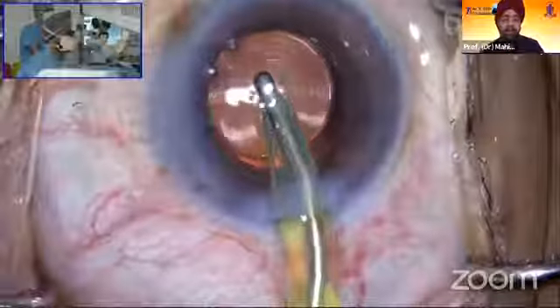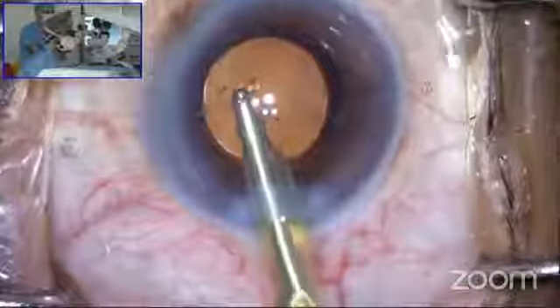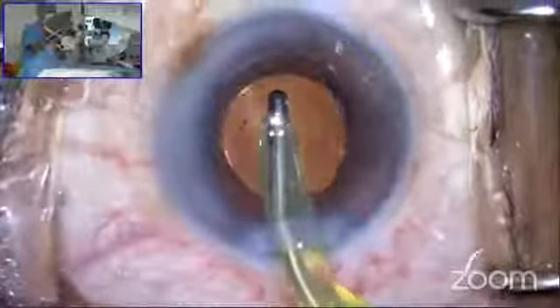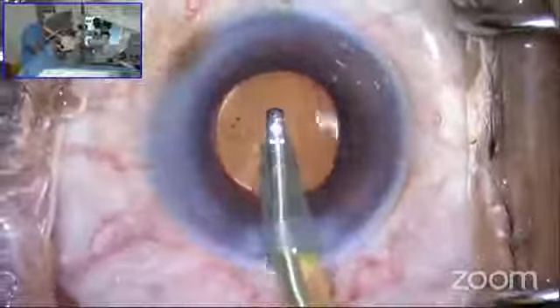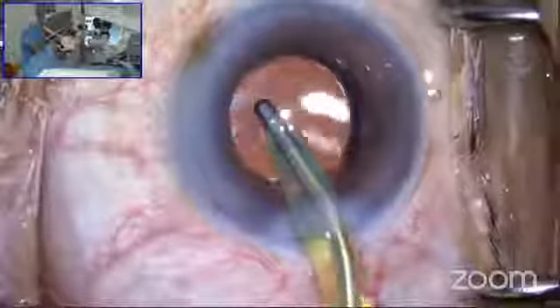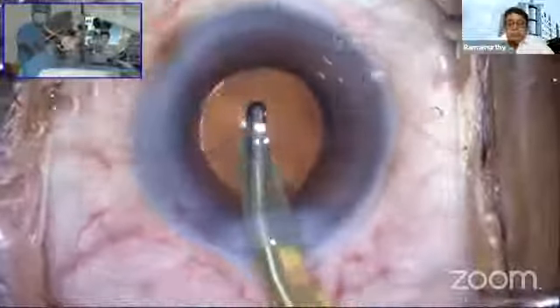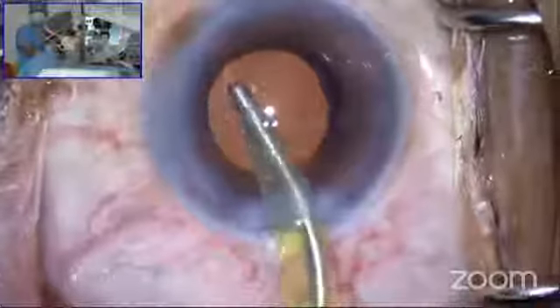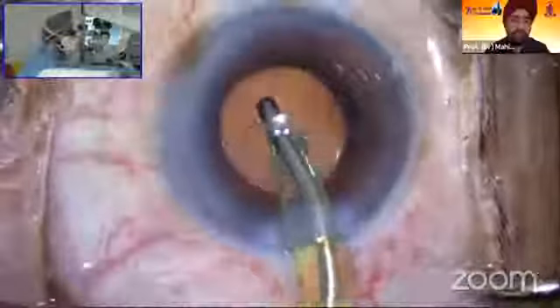This is pretty much the end of the surgery. The viscoelastic will be taken out and we will hydrate the wound. The second surgery is also a Synergy case, so maybe we can have the full discussion right after the second surgery. Dr. Ramamurthy is also planning a Synergy case. Both of you are probably showing the same thing — you can show your video and then we can have a discussion on Synergy and femto together.